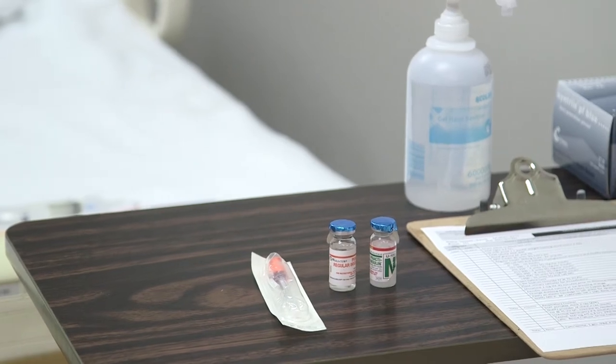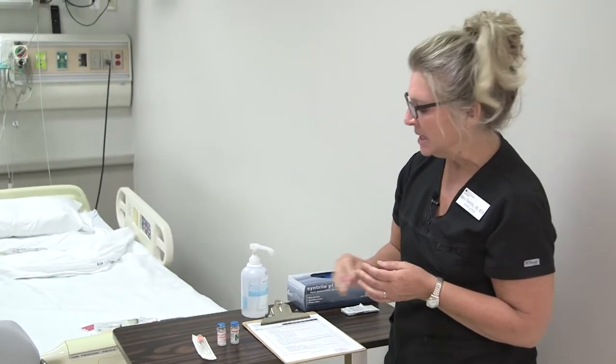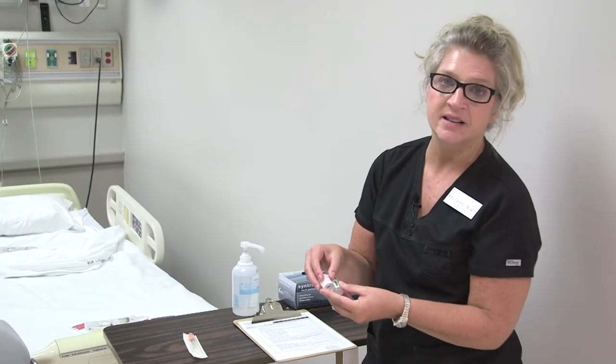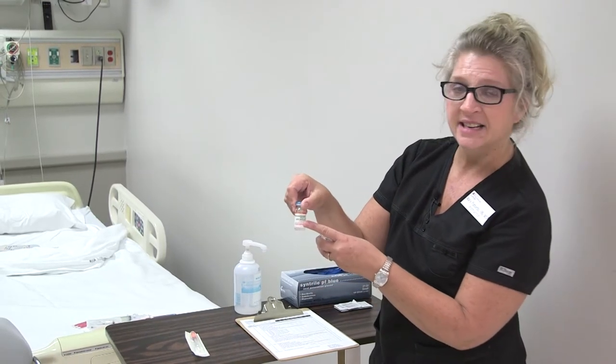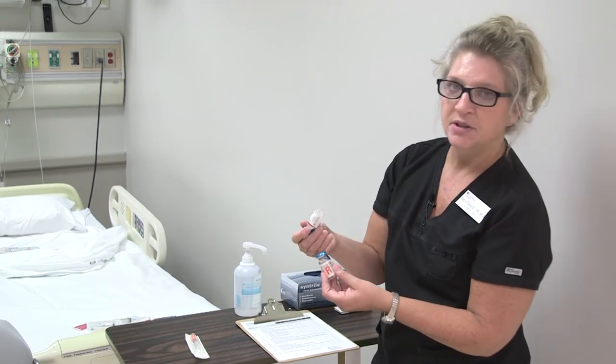Today I'm going to demonstrate how to mix insulins. The two insulins that you will see in practice that are mixed are regular humulin insulin and intermediate-acting NPH, or N, insulin. Those are the two that you can mix together.